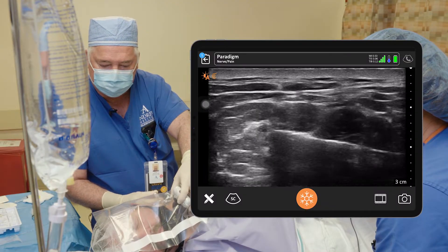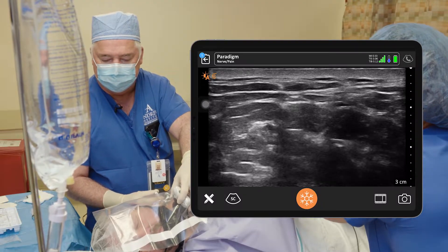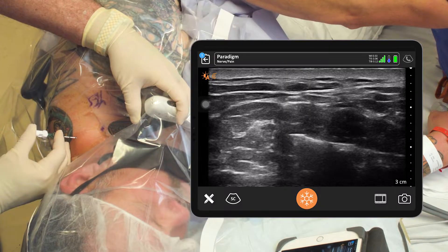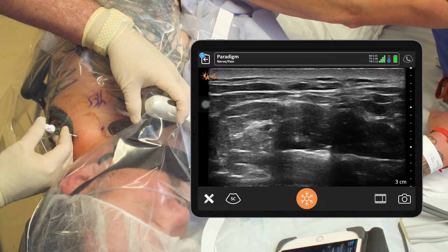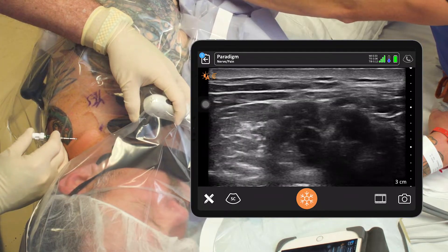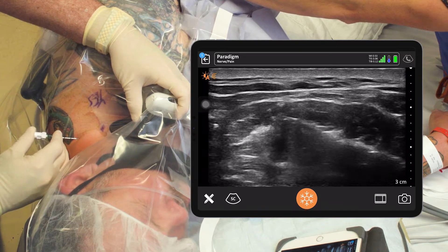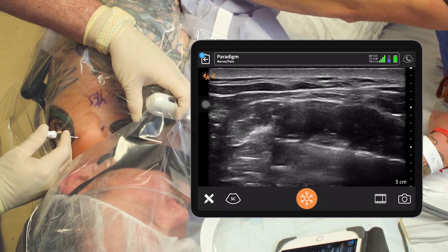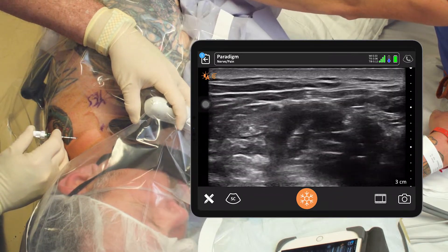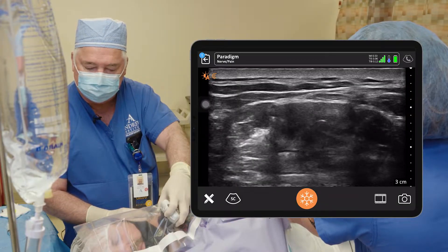I think I'm in there, so I'm going to give a couple CCs and see what we've got. Aspiration is negative — I think we're in the right space. Give me five. It's opening up that space between the nerves and the middle scalene really well. You can see it right there. Now we've opened up that space really well.